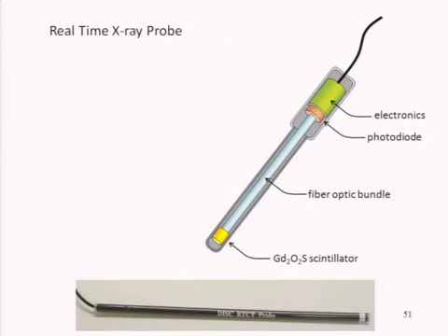Moving forward, I always thought it was a tedious thing to have to scan for every point on the rise to equilibrium curve, and I've been advocating real-time dose response curves lately. I was working with a company in Canada to do this, but many other manufacturers have these real-time probes.